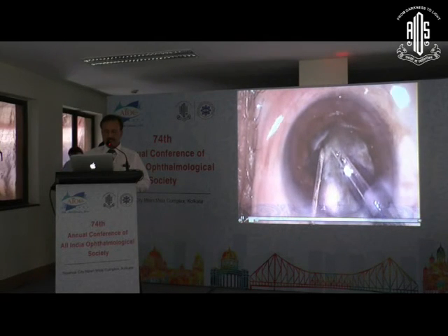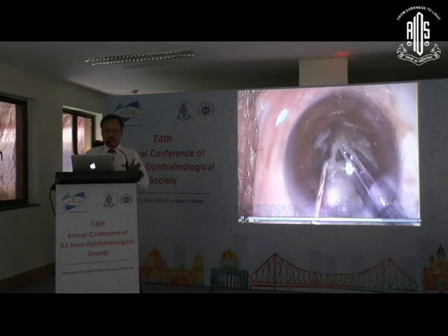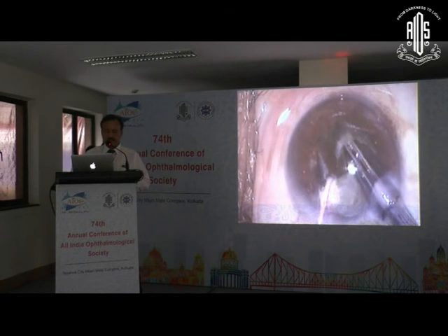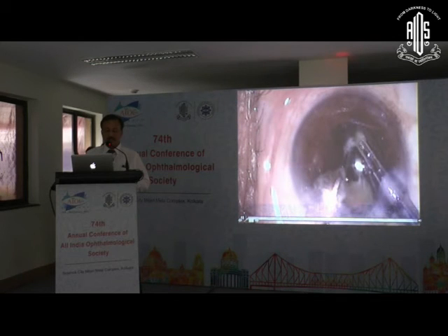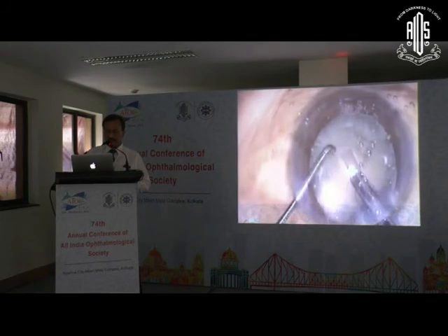And then after that, you see the movement of both the instruments, because both the instruments have to move away from each other. It's called a lateral separation force, a dispersive force. And see how you can get the segmentation of even the black cataract, a very hard cataract, where otherwise we wouldn't have thought of doing phacoemulsification in such a situation and would convert to ECCE. But here with this technique, you can segment any kind of hard cataract into two complete segments.